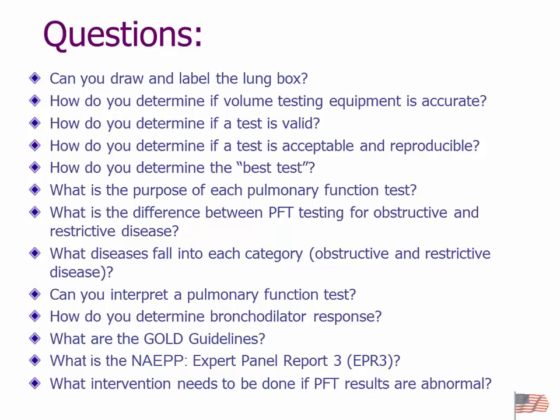How do you determine if a test is valid? Is it done correctly? Did the patient give their best effort? Is it reproducible? We're not going to worry so much about this thing called the best test, because the machine will actually determine that for us, but there is an algorithm that can be utilized to do that. Why am I doing each test? Why am I doing a maximal expiratory pressure? Why am I doing a maximal inspiratory pressure? Why am I doing an FVC?